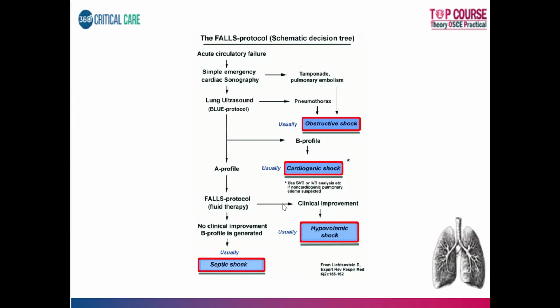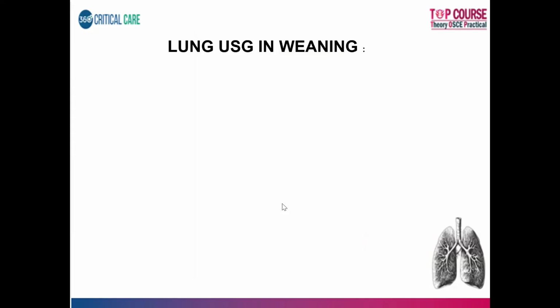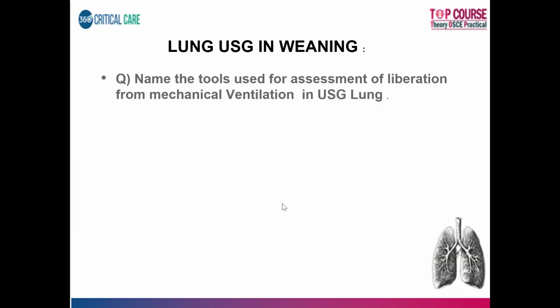Okay, so this is by and large about BLUE protocol and FALLS protocol, especially which involves lung ultrasound and cardiac scan. Okay, coming to the use of lung ultrasound and weaning. Okay, so name the tools of assessment which are used for liberation of weaning in lung ultrasound.